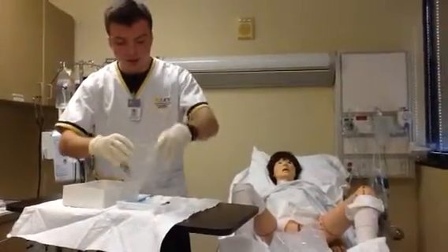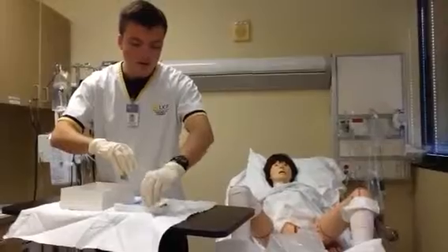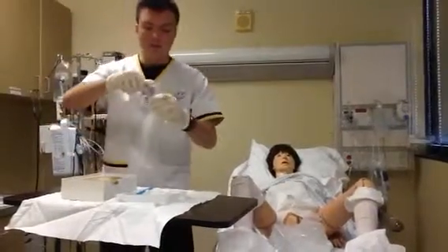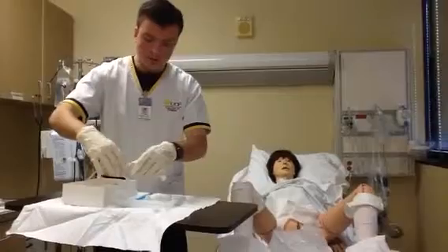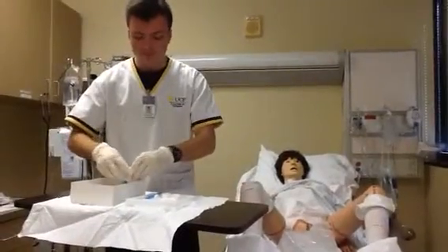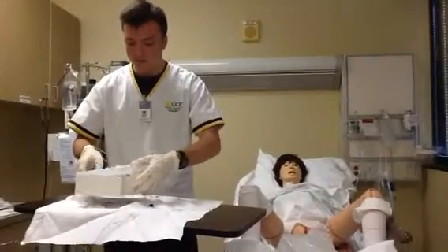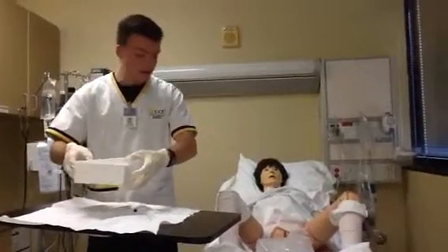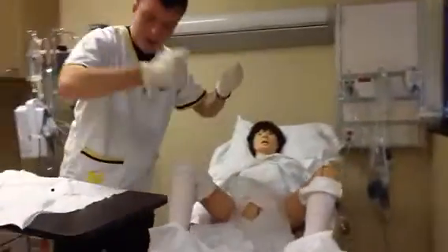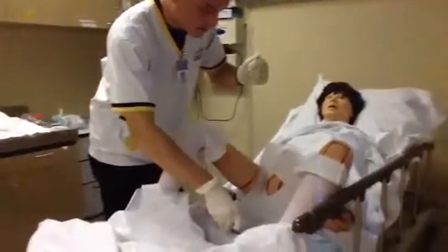I'm going to lubricate the tip of my catheter. Okay, the tip of my catheter is lubricated. I'm going to place it back inside the container. I'm going to take my syringe. I'm going to go ahead and lock it in. And I'm going to place it in the container. This time I'll take the plastic top, set it up, making sure that I keep my body facing the sterile field and I'm working inside of the 1-inch borders because I'm currently sterile. Drop that, and at this time I will move this out of the way, and I'm ready to begin my catheter insertion.